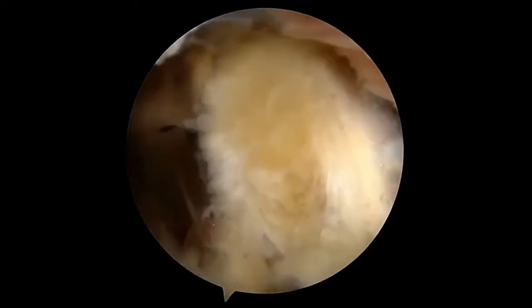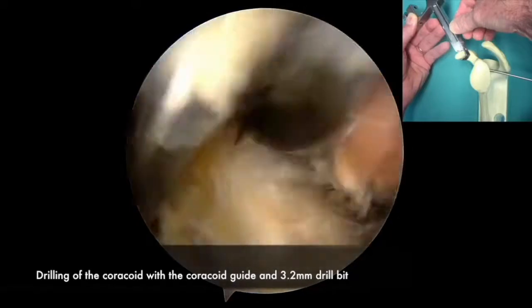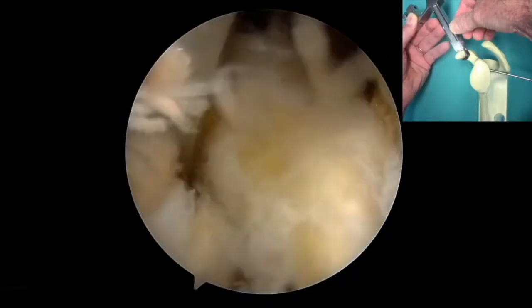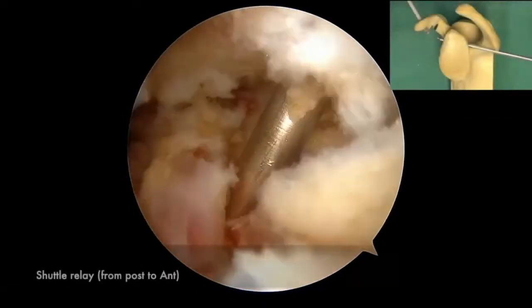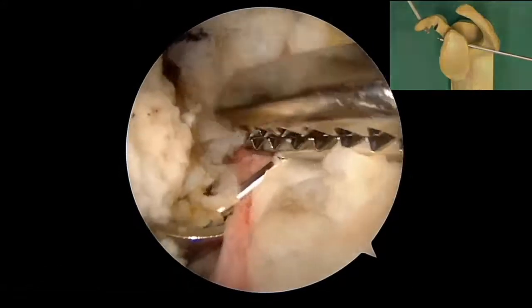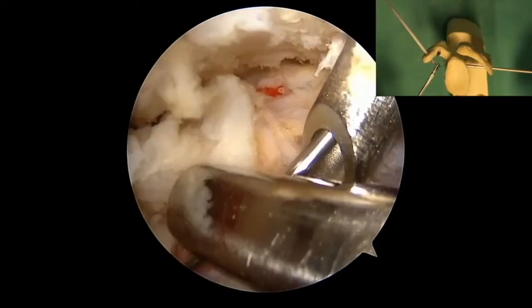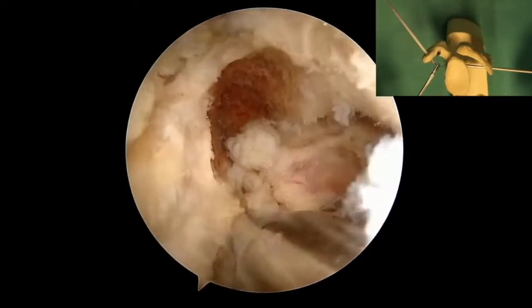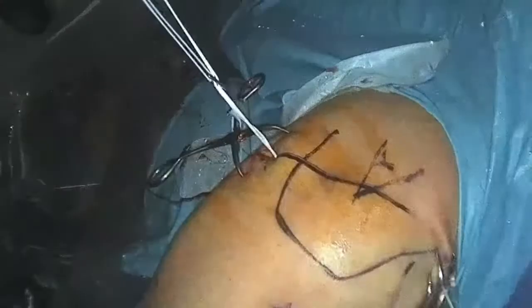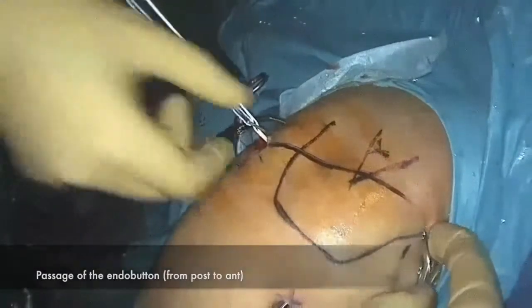A second coracoid guide is introduced via the coracoid portal to grasp the coracoid perpendicular to its surface. A 3.2 mm tunnel is drilled in the distal aspect of the coracoid 1 cm from its tip. A metal sleeve is inserted and the guide removed.